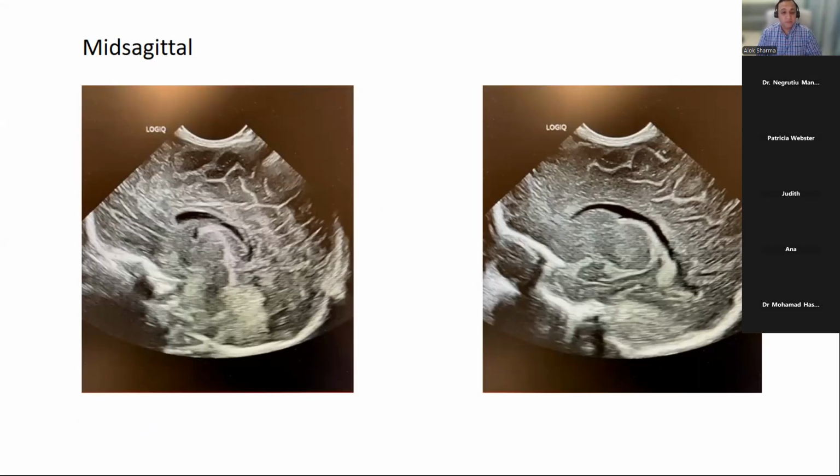It's beautiful. It's absolutely beautiful. So, the first one with the lateral ventricles, and I think you can't really see the, is that the corpus callosum over the top there? Yeah, that's correct. I can see it very well, and I can see it right till the anterior. The fourth ventricle, yep, and the cerebellum at the back with the vermis here.